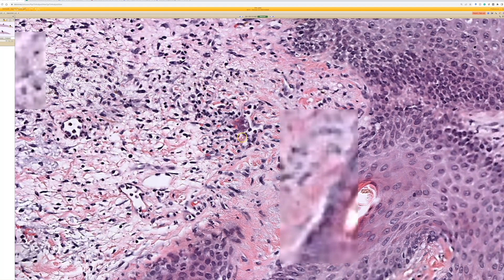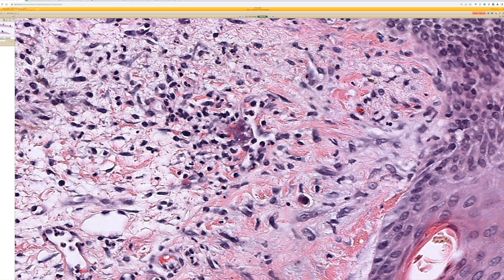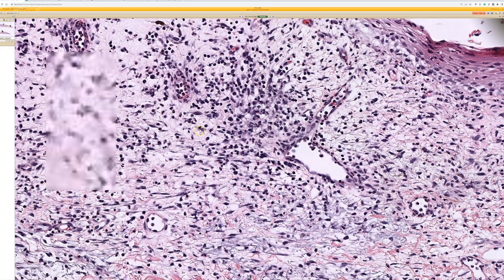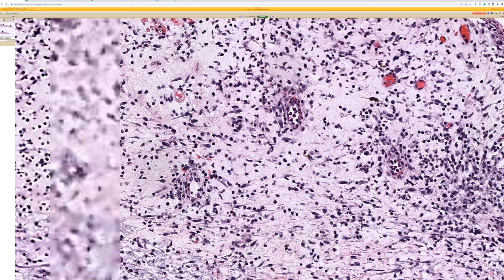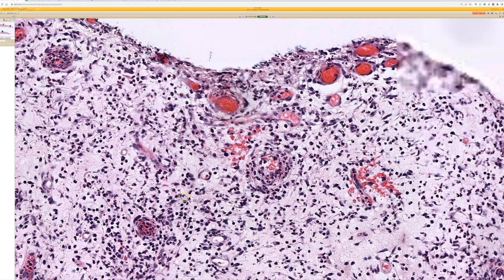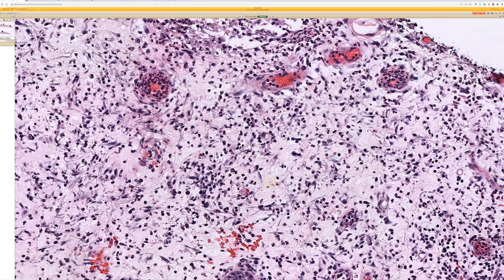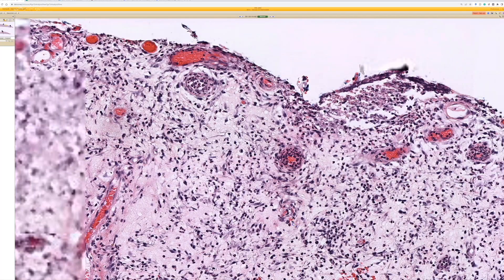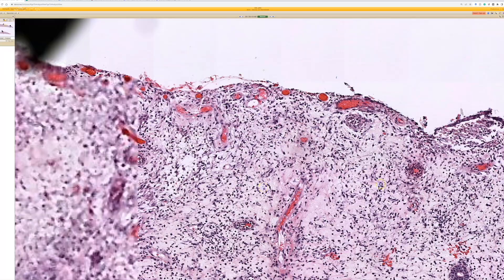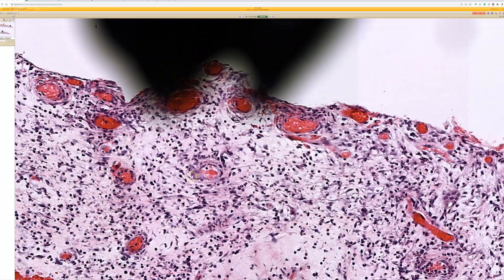Right here — yes, this is cytomegalovirus. This is one that's almost like an owl eye look, but I wish it was a better scan. I have not recognized a case of this yet in practice; it is relatively rare. Even having seen quite a few immunocompromised patients who would be candidates, I've not yet diagnosed a case. CMV most commonly affects the endothelial cell, so looking around the vessels is your best bet.